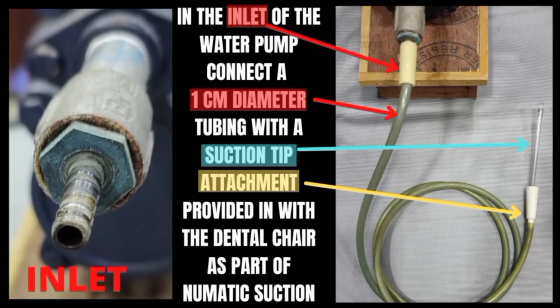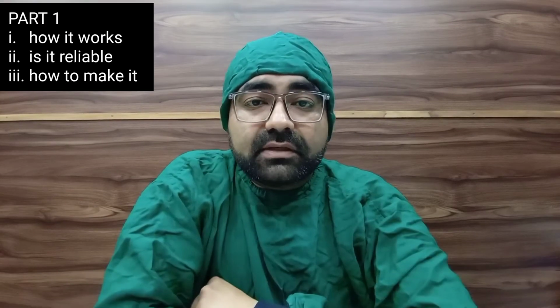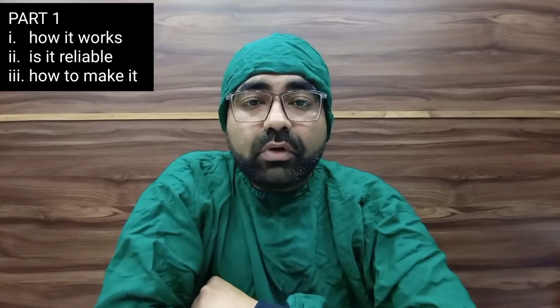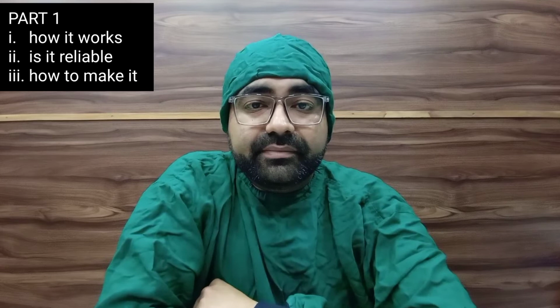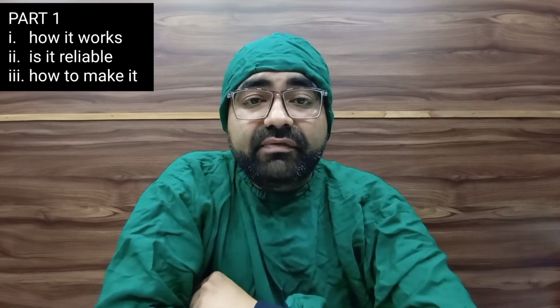disposable suction tip. Now in order to create a good pressure in our suction, the diameter of the inlet pipe should be small, that is approximately 1 centimeter. The length of the inlet pipe can vary from 3 feet to 5 feet.